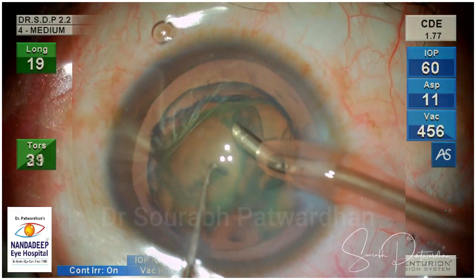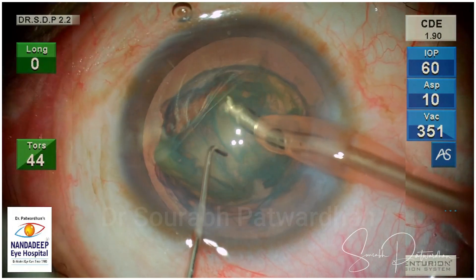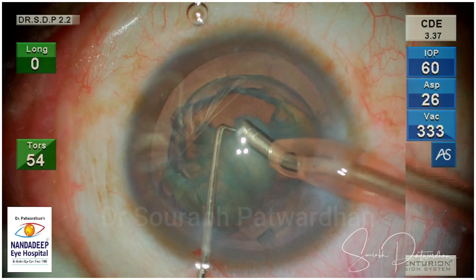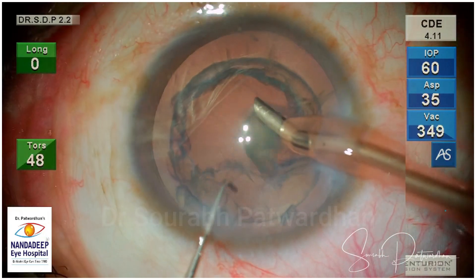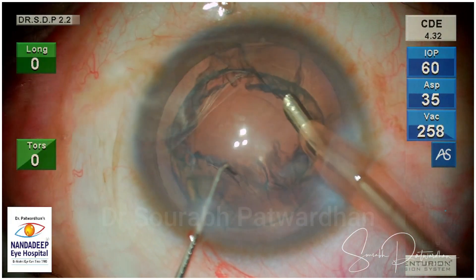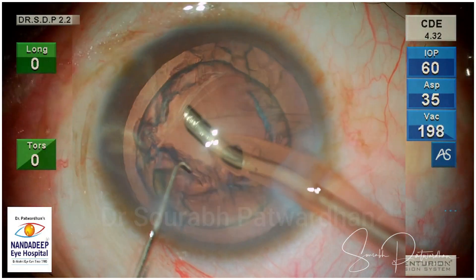Once the nucleus is lifted out of the bag, you can just emulsify it. It is a soft grade 1 to 2 cataract and you can emulsify it very easily without need of any divisions or further separation. That is a nice trick to have, particularly when dealing with these kinds of cataracts which are otherwise soft but have nuclear sclerosis.